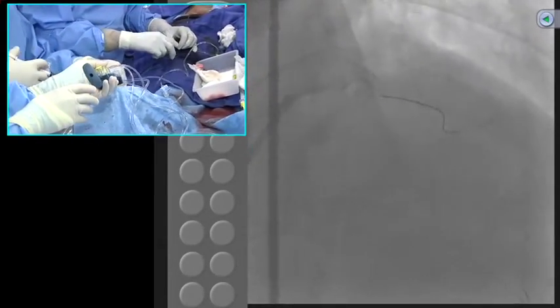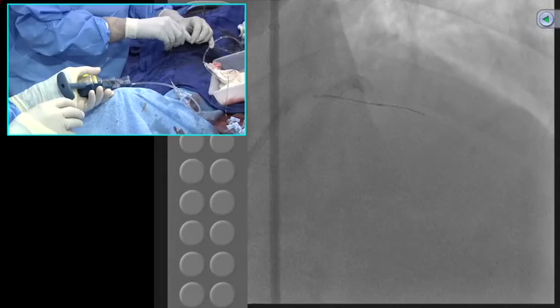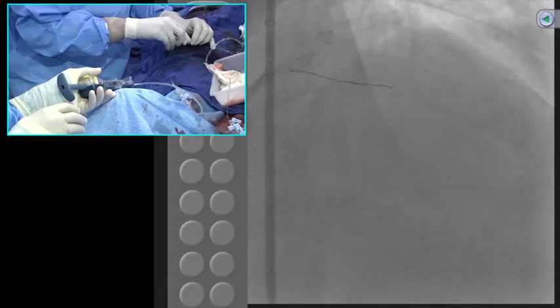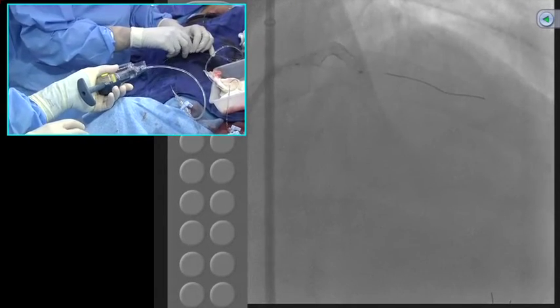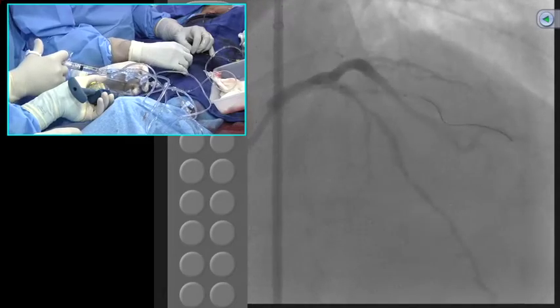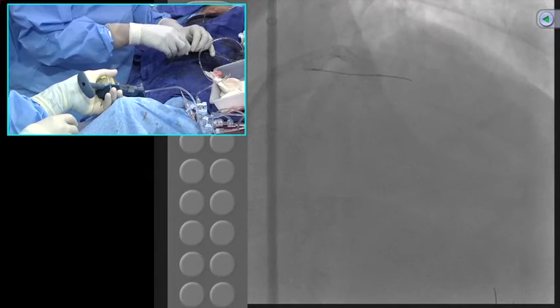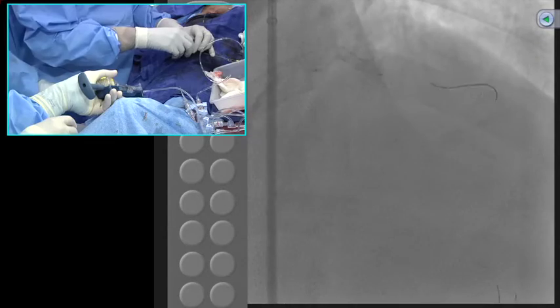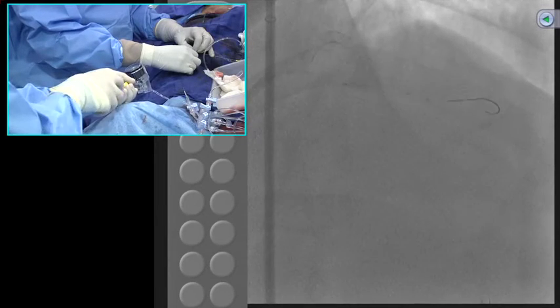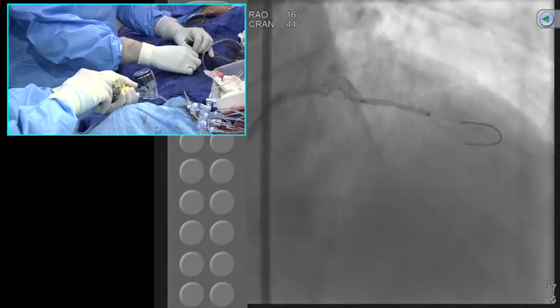Here is one more, the last of the series of follow-up questions. How many DES layers have you had in a patient who came to you? I have patients who have come with 5 and even 6. And you know our algorithm which we showed a few years ago: if you have more than 2 layers of stent and the patient has come a third or more time, we do an IVBT. We do about one every month, like today I had 2 cases. We are the only ones who do IVBT in this area, so we get selective referrals for refractory ISR, which is a third episode with a minimum of 2 layers. The maximum I have seen is a case who had 6 layers of stent in that vein graft. And every time you put an additional stent, your minimum lumen diameter will continue to decrease.